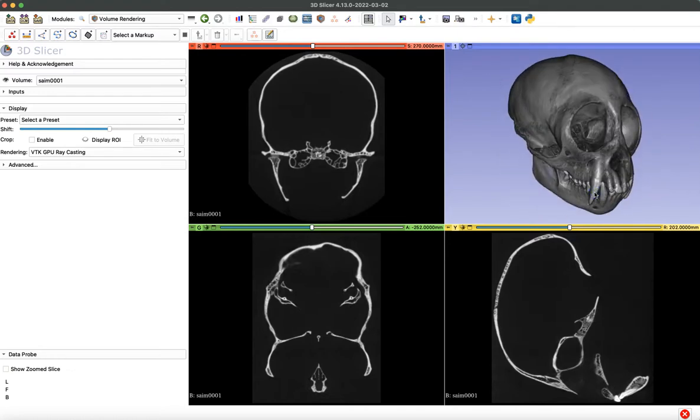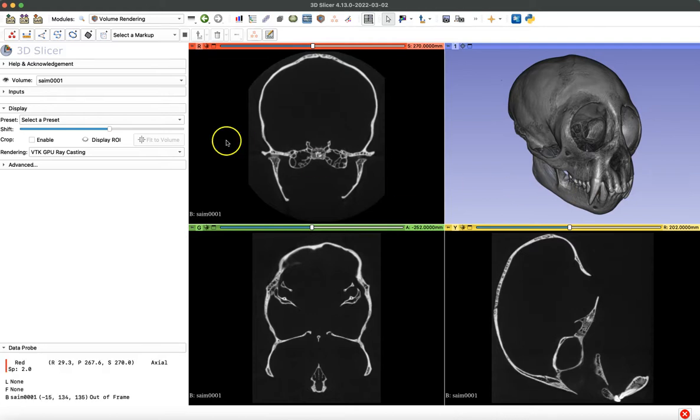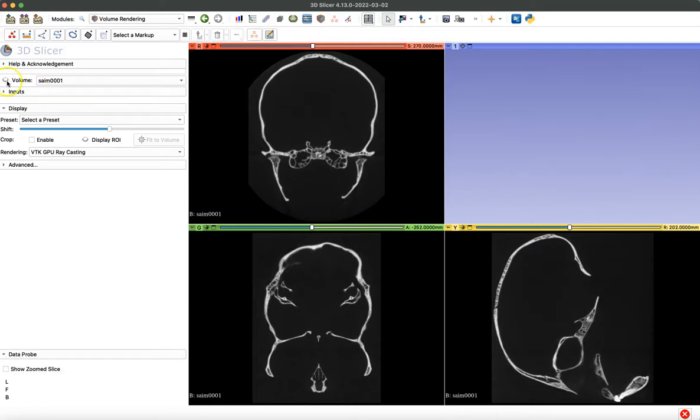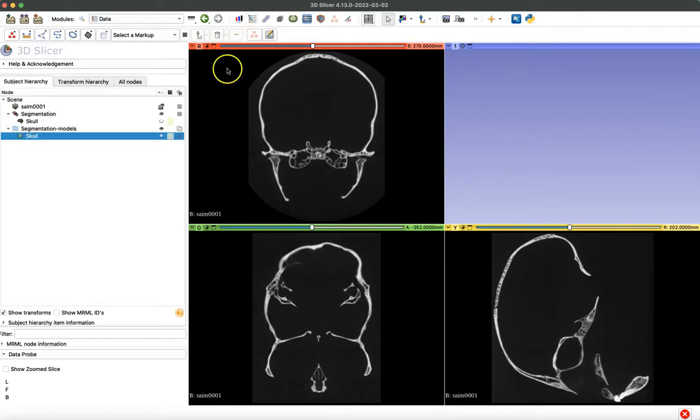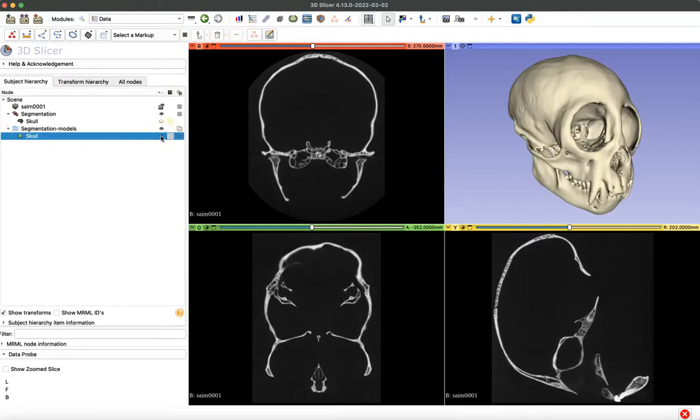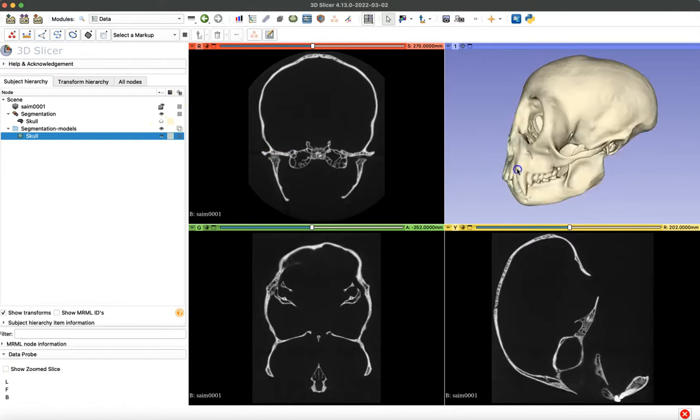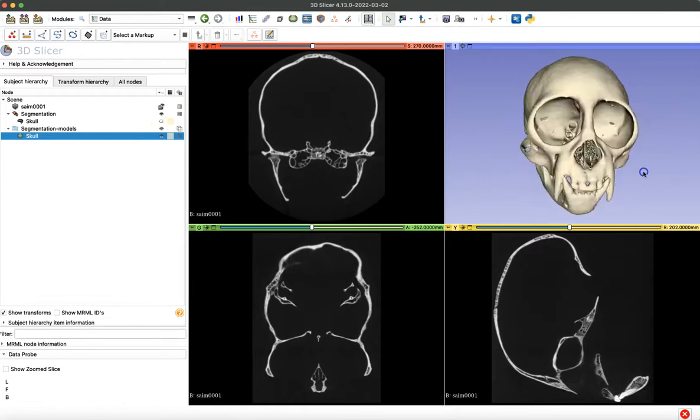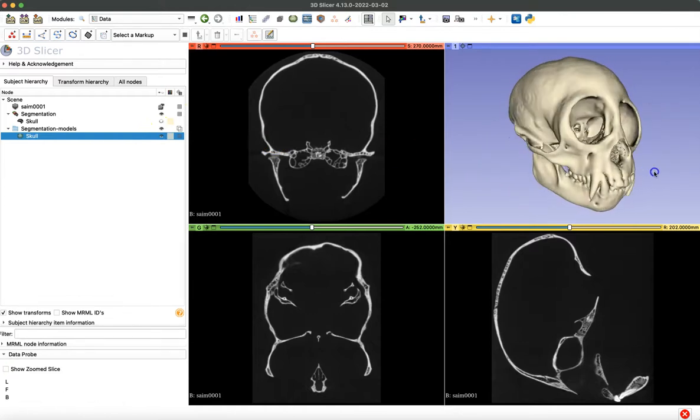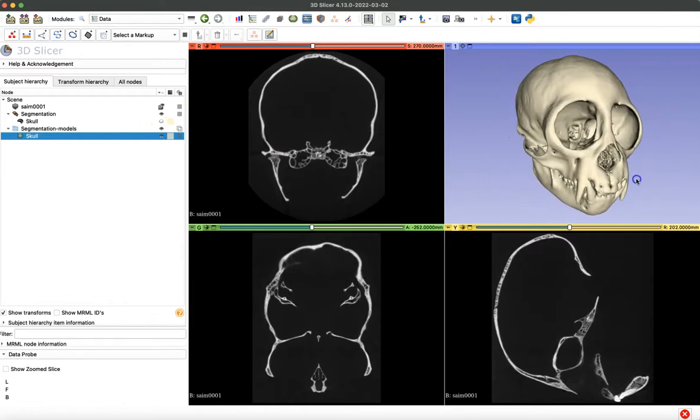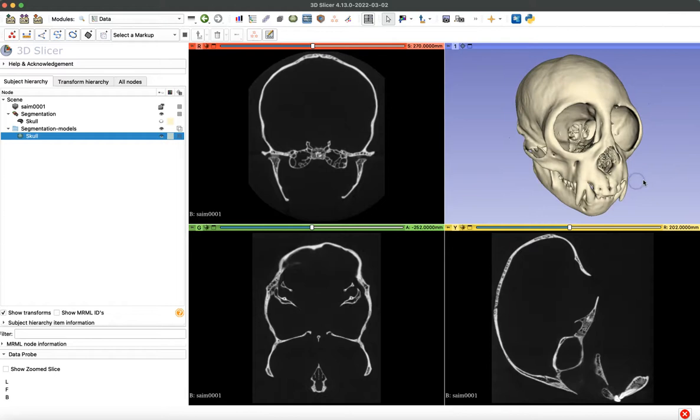So now I'm going to turn off that rendering and navigate to the data module. Here we're going to turn on the visualization for the skull. I've prepared a model of a skull for us to practice taking our measurements on today. And if you want to learn how to do these first few preparation steps, just check out some of the other tutorials from our lab.